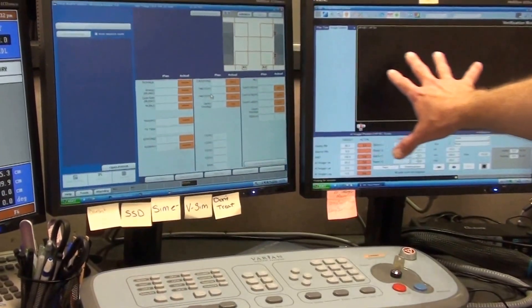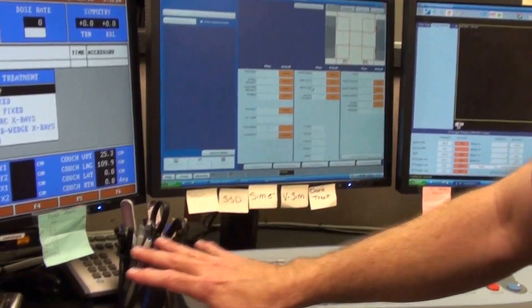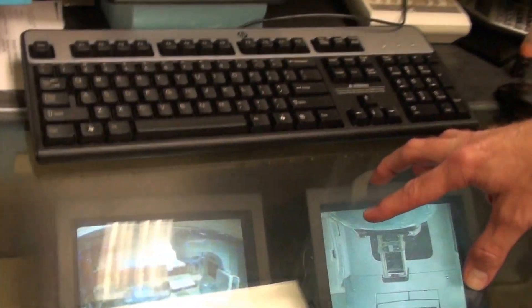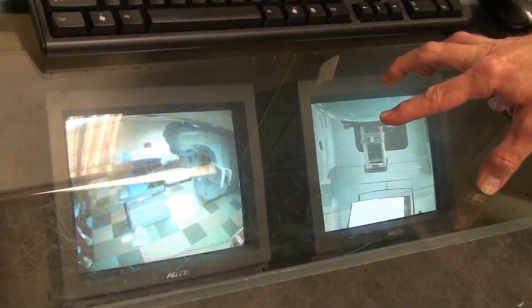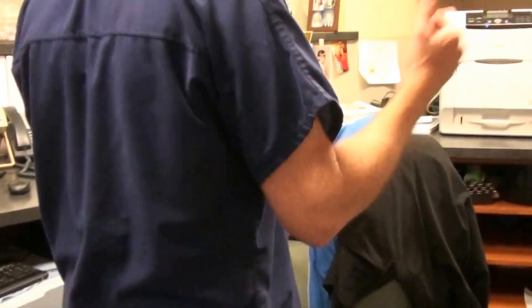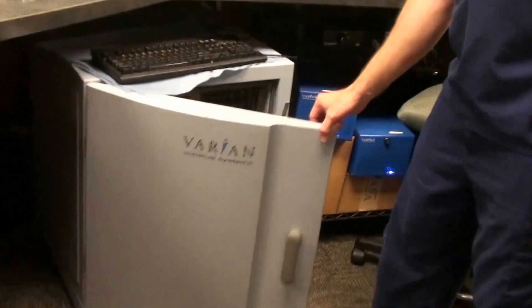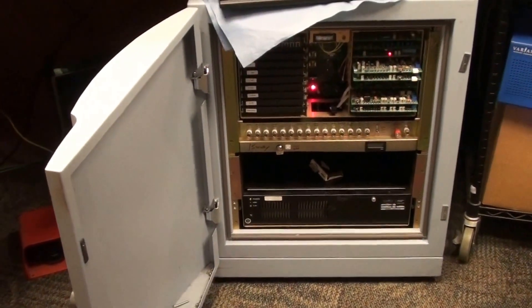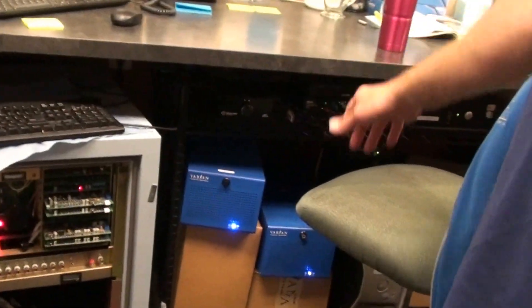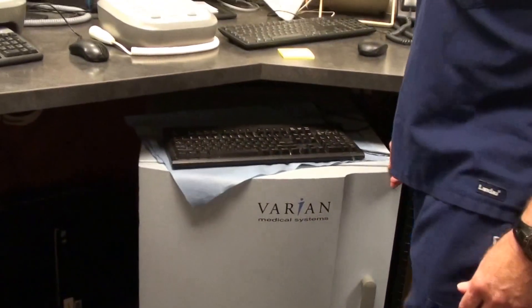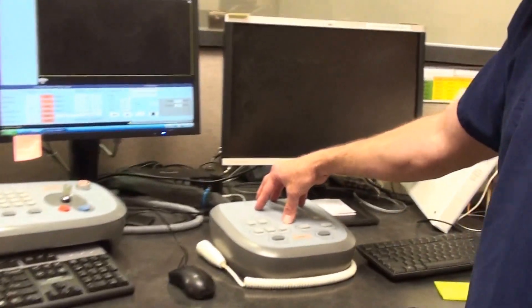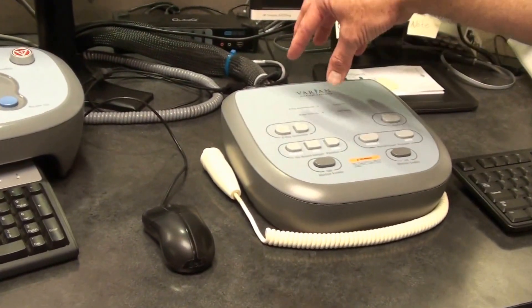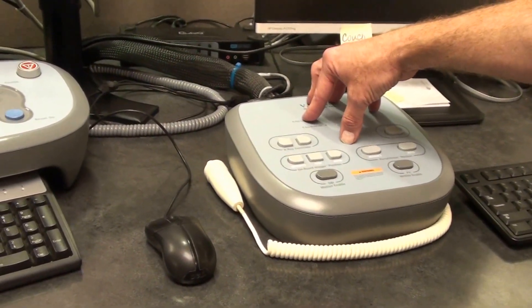We have some secondary computers here for imaging, and we also have an audio monitor. We have cameras in place so we can always see and hear the patient at all times. The modulator is inside the treatment room. This is one of the other computer banks, and various other CPUs on this particular unit. We have imaging — we have a kV imager and we're able to do kVs and cone beams, which we will discuss at a later date.